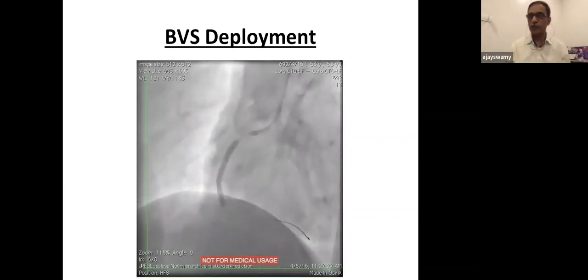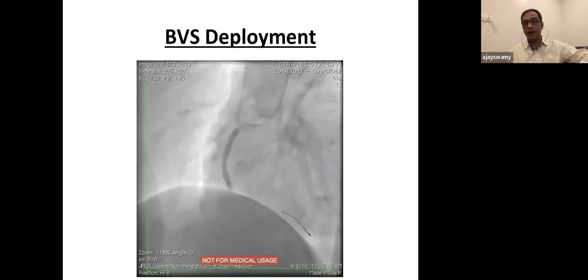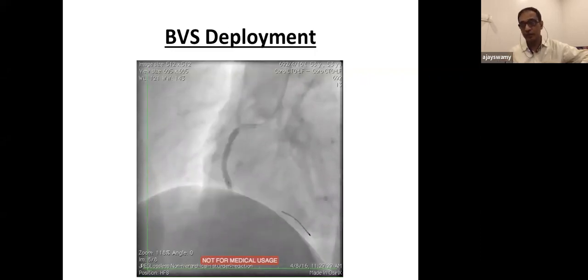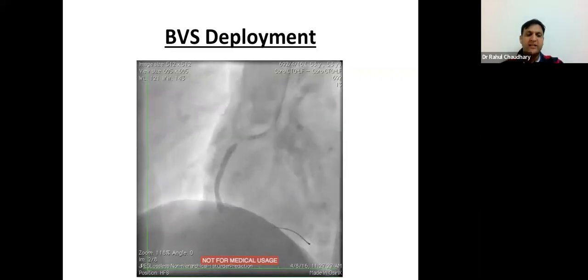The stent is not going to thrombose. The only rider is as long as you have hardware inside the coronary. That means something that is still there, not a stent, but something that's still there. At that time, it is dangerous to reverse it because you can end up with thrombosis on the wire, on the balloon, etc. So the second thing is we often use cutting balloons to modify calcified plaque.